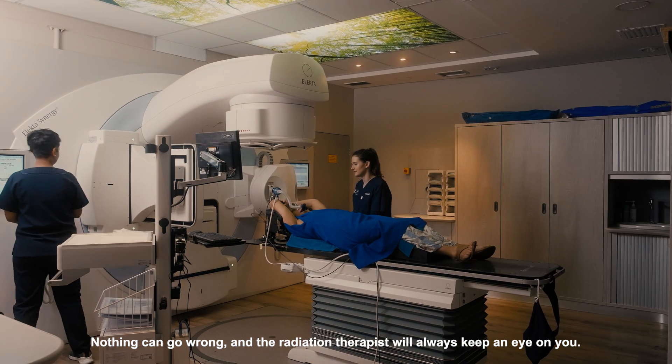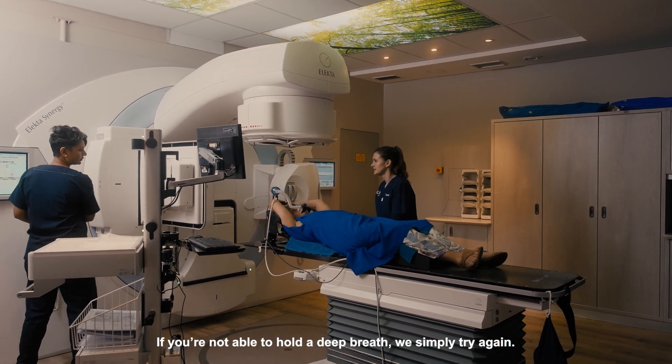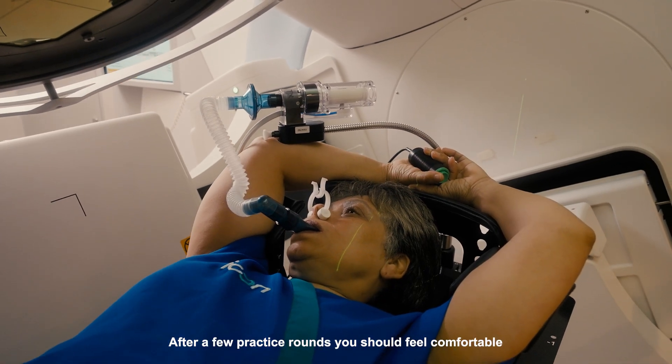Nothing can go wrong and the radiation therapist will always keep an eye on you. If you are not able to hold a deep breath, we simply try again. After a few practice rounds you should feel comfortable.